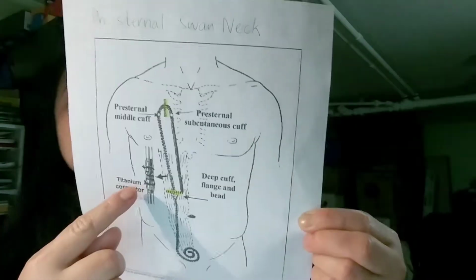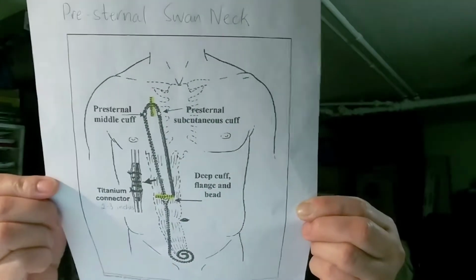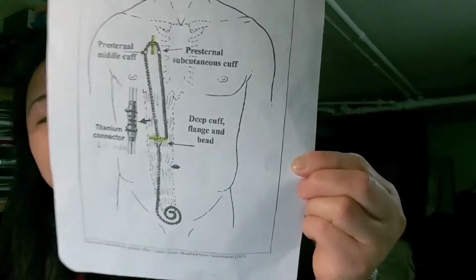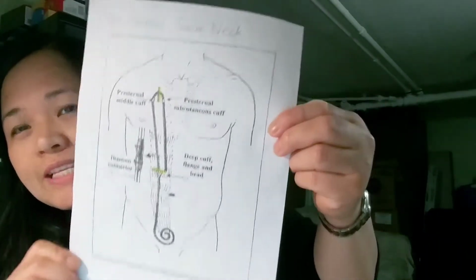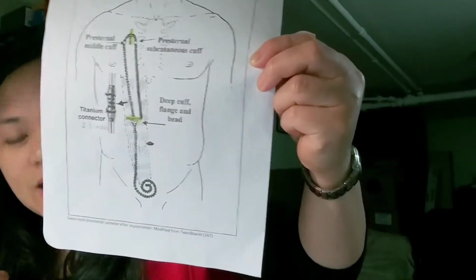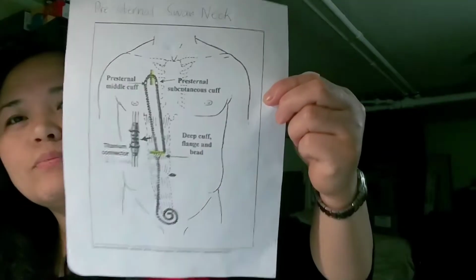It is usually good because there is less movement on the chest wall, and it facilitates healing and decreases the trauma risk. But it should not be put on the sternum if the patient may need open heart surgery in the future. The rationale for me choosing this catheter is because it causes less abrasion to the exit site, and because it's made of silicone, which reduces the danger of intestinal or organ harm during insertion and use. It's really biocompatible.